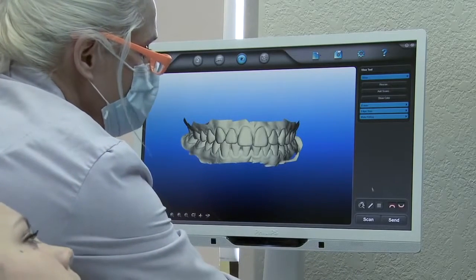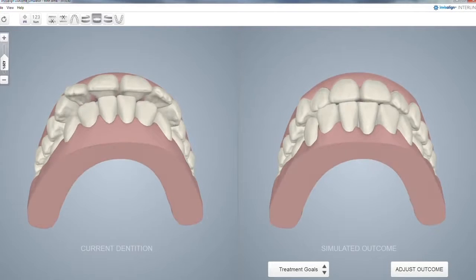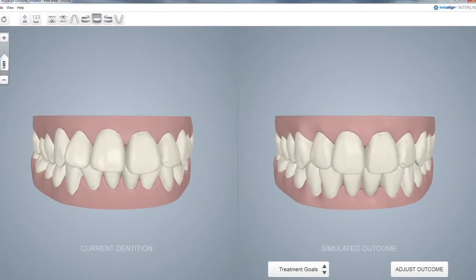The completed scan is then sent on to Align. With an iTero Invisalign scan, the Invisalign Outcome Simulator can then be used to help increase patient acceptance by showing them chair-side what their teeth might look like after treatment.